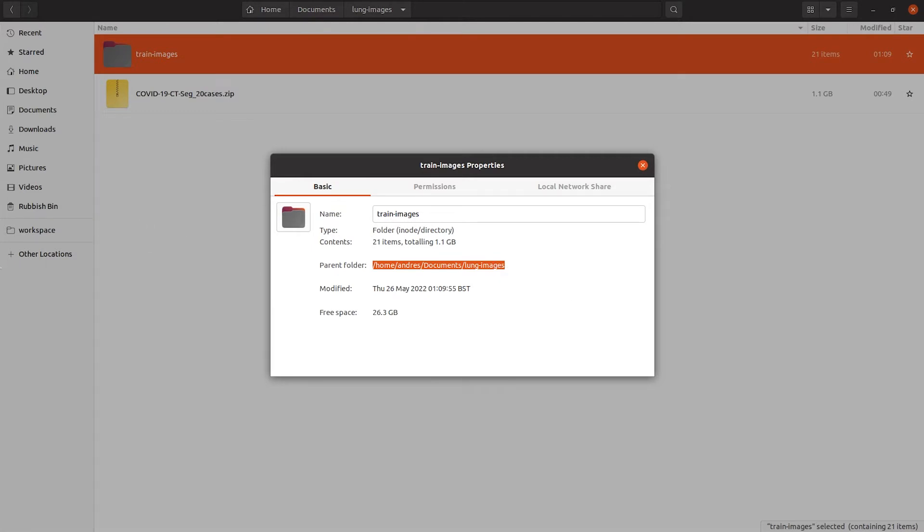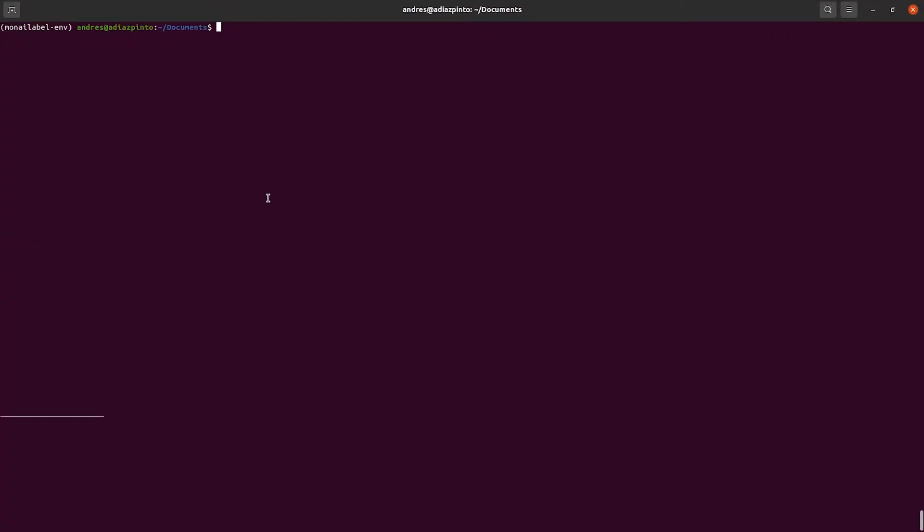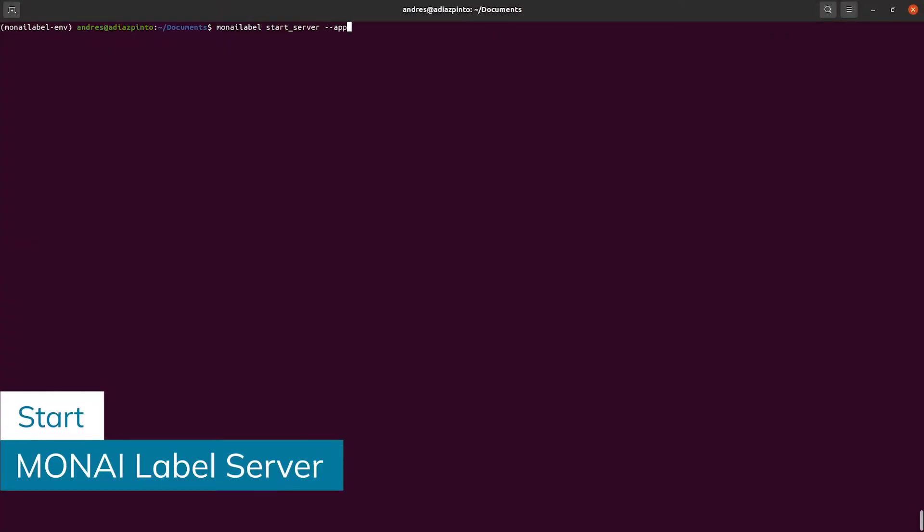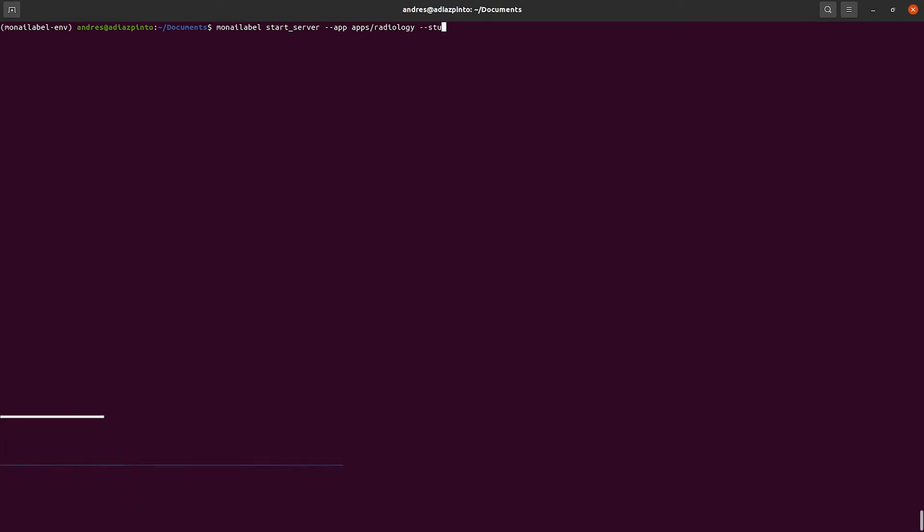Now let's start the server. We have everything we need to start the Monoilabel server: the Radiology app with the Segmentation model and the data set ready.